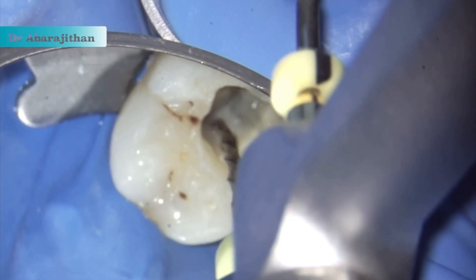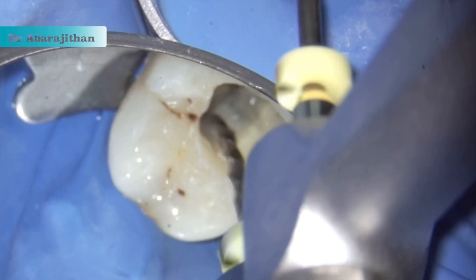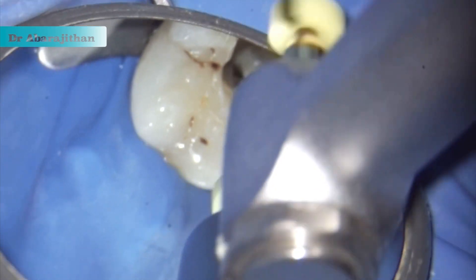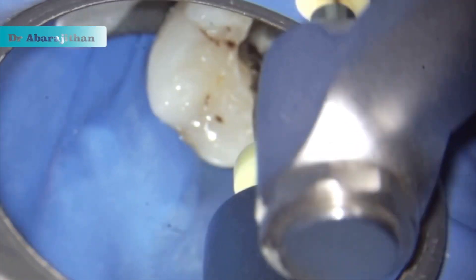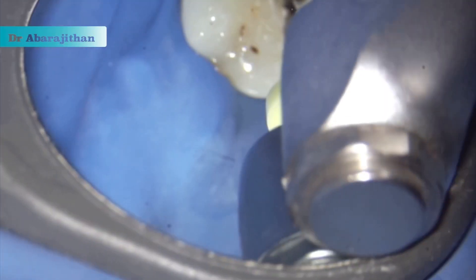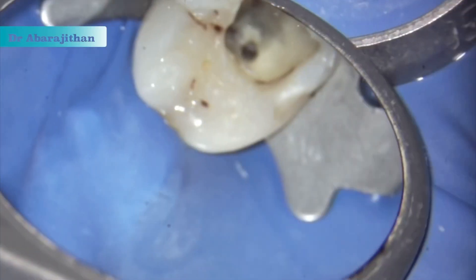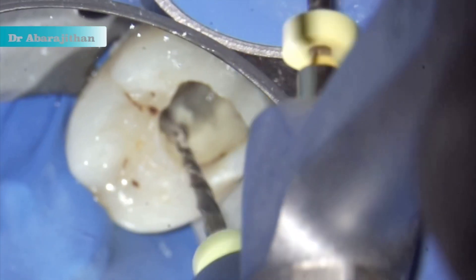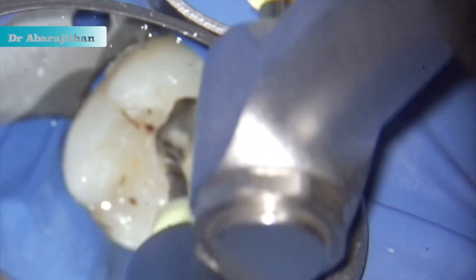I explore the area with the rotary orifice shaper, and once I confirm the canal, we complete the shaping and cleaning of the middle mesial canal as well.